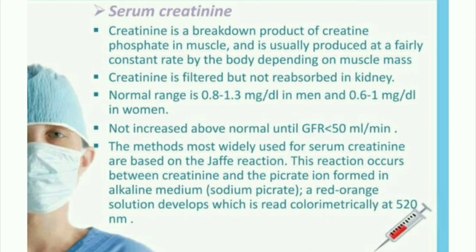The reaction occurs between creatinine and the picrate ion formed in alkaline medium, sodium picrate. A red-orange solution develops, with the color measured colorimetrically at 520 nanometers.